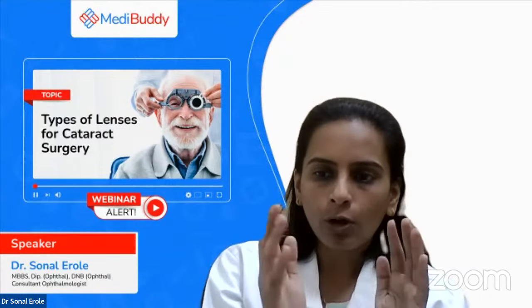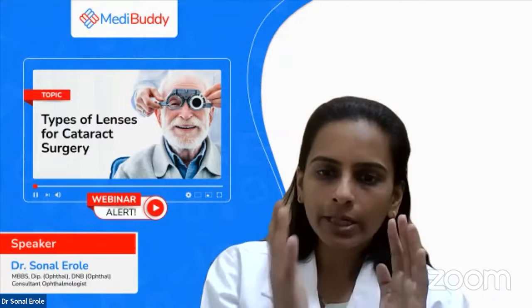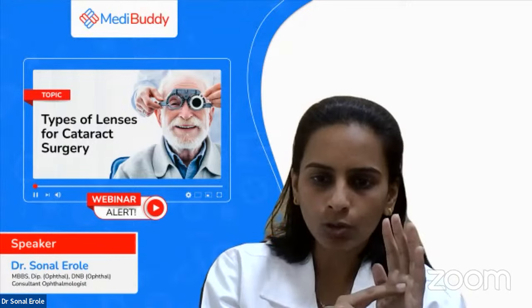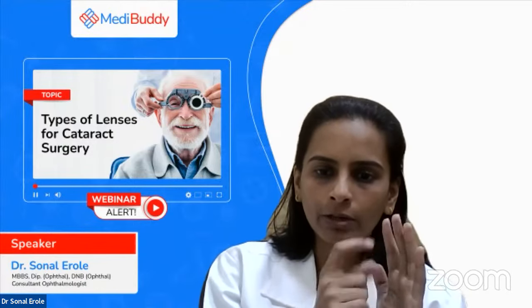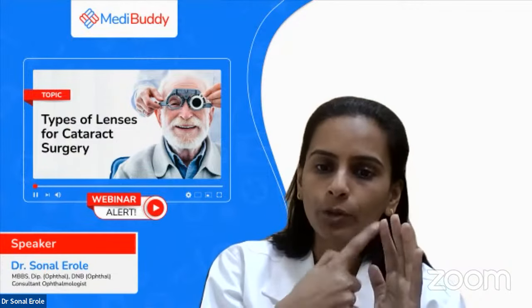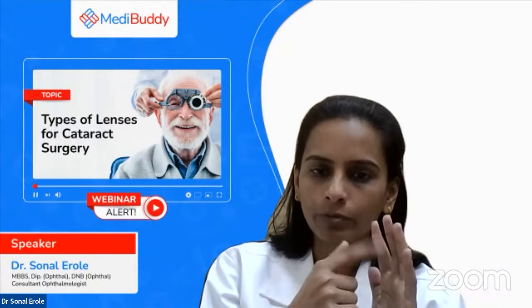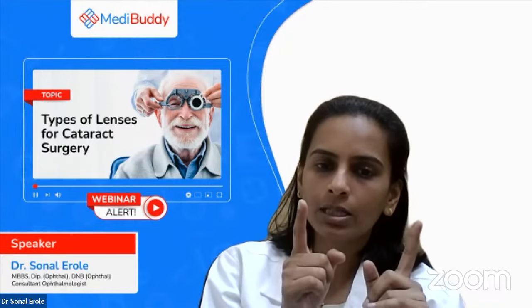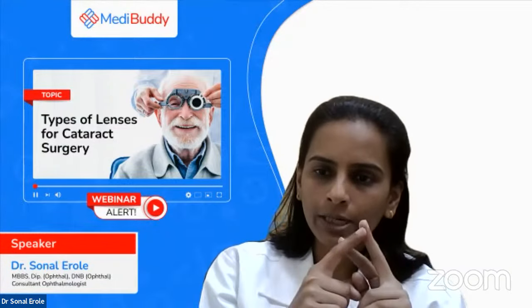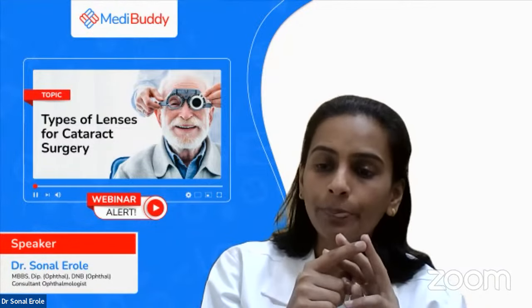If you are thinking now, almost 1 year has gone since February 25th, now February 24th. Removing it and putting a monofocal lens can be an option, but it can be a difficult thing also, because if these adhesions are more and you try to scratch and remove the lens, this bag might get compromised. If the bag gets compromised, then the options remaining after removing this multifocal lens will be scleral-fixated lenses or iris-fixated lenses. So it depends on your condition. You have to get your checkup done, and it will depend on your surgeon's advice what to go for.